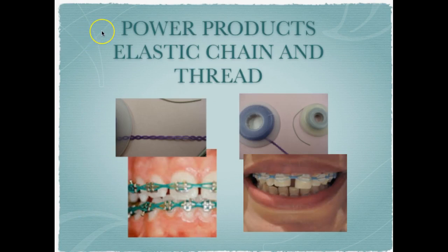To create additional force in tooth movement, materials such as power products might be used. One of these is the elastic chain, and you can see it's a series of circles all connected together. It's rubber, and it does have elasticity. So this would create force on the teeth, usually used to close diastemas. And you can see here that sometimes it may include the arch wire, or there are some situations where brackets are placed and then the elastic chain is placed prior to the use of any arch wires.